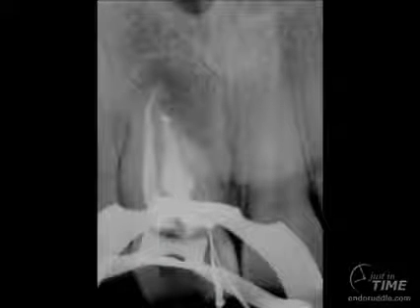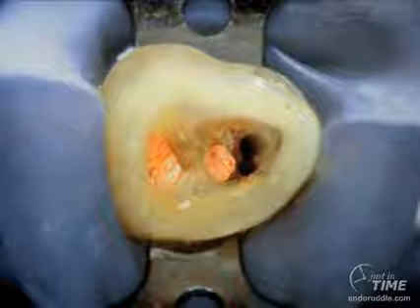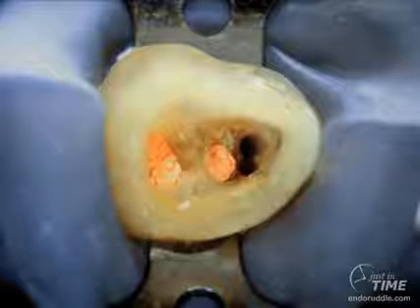Well, as work is continuing, you can see two canals have been negotiated, shaped, and three-dimensionally filled. And you can see the anatomy of the far left system. You can see the resorptive area has been obturated, and two more systems were identified. And if we look at the photograph, you can see that there is a facial and lingual branch making this central incisor a four-canal system.